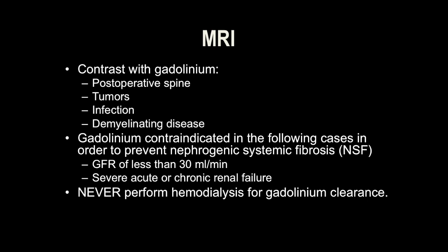It is important to be aware that we should not administer IV gadolinium contrast in patients with a GFR of less than 30. Gadolinium is not considered nephrotoxic; however, in patients with low GFR who cannot excrete the contrast, there is a risk for nephrogenic systemic fibrosis, which has only been reported in patients with GFR specifically less than 30.